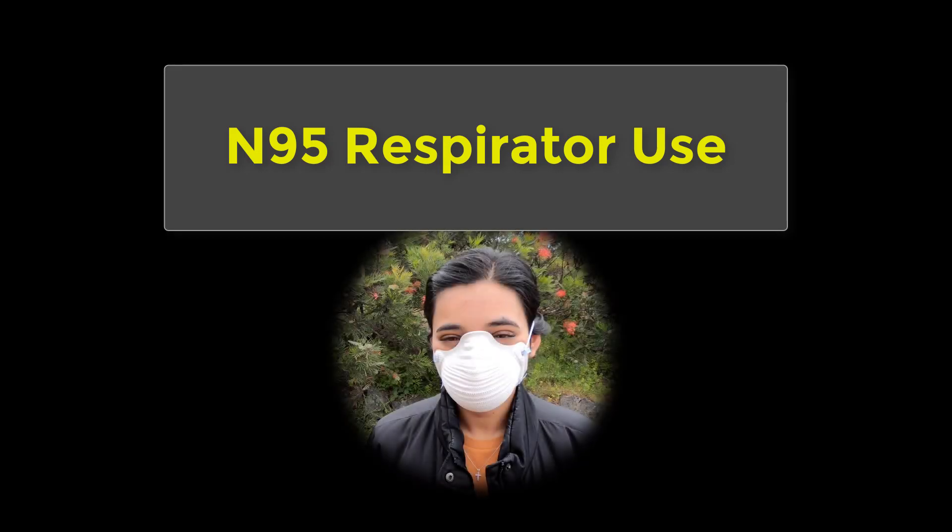This video covers the proper use of an N95 particulate respirator.